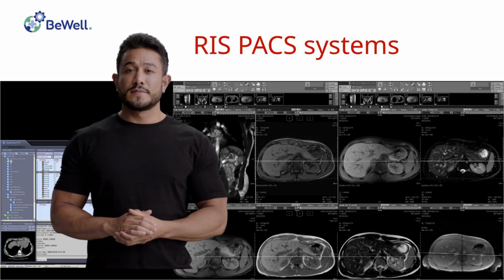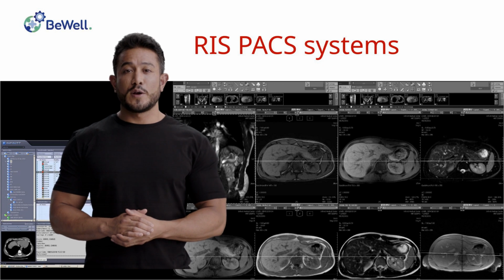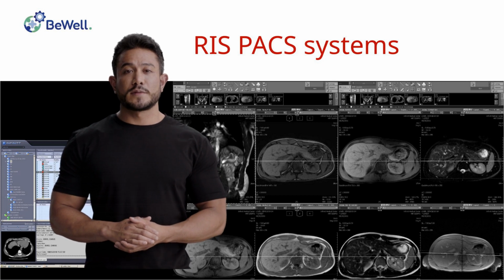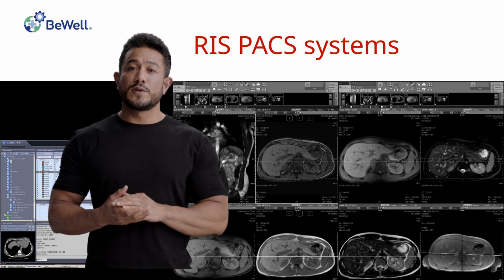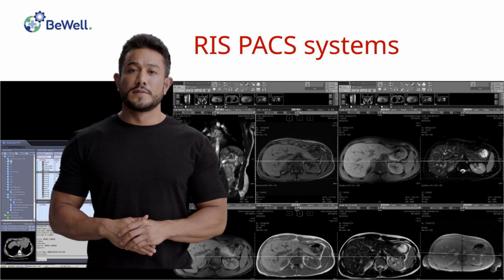Let's go. As a typical scenario, a patient is admitted to the hospital. They must register and an order is entered into the information system. If the patient requires an X-ray, an order is entered and scheduled into the system. After the procedure is performed, the images are stored and can be retrieved, studied, and shared across multiple departments.